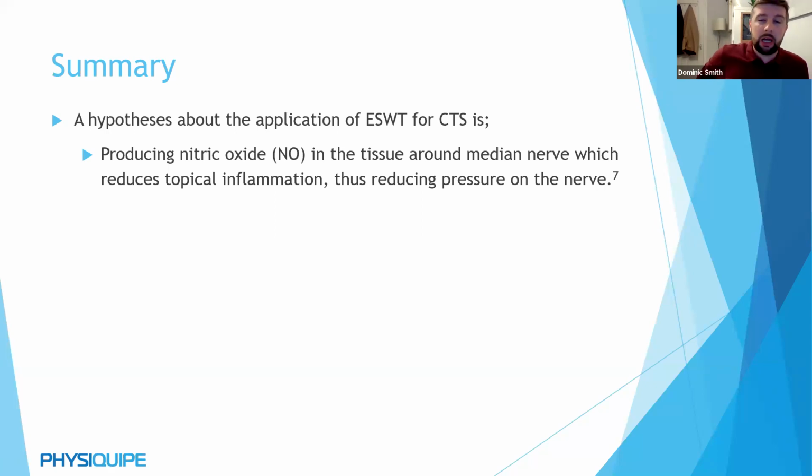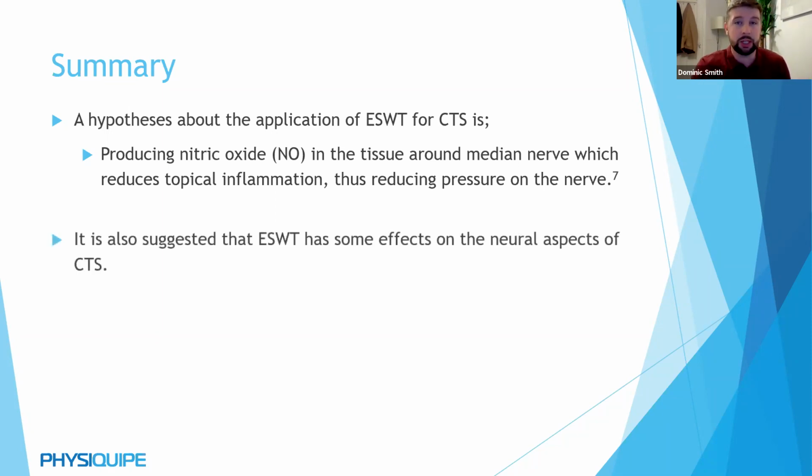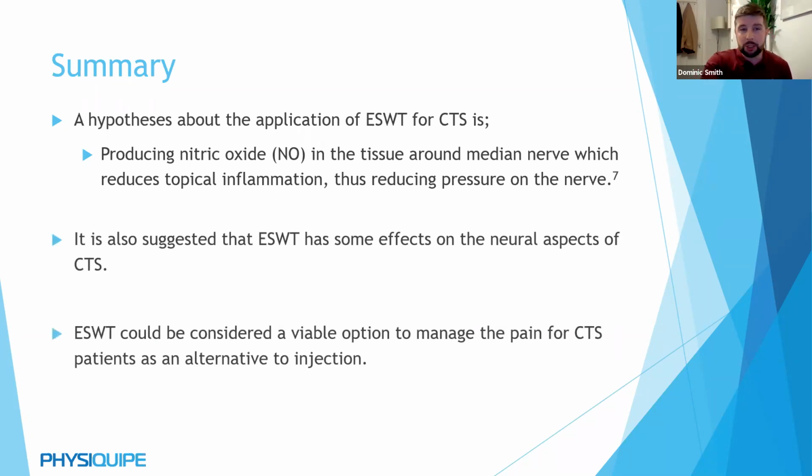And then again, in summary, if we look at the hypotheses that the researchers have been pulling together for Shockwave for carpal tunnel syndrome, there is evidence that it's producing nitric oxide in the tissues around the median nerve, which reduces the topical inflammation, thus reducing the pressure on the nerve. And that is the idea of what Shockwave is doing. It's reducing the pressure on the nerve. It's also suggested that Shockwave does have effects on the neural aspects and could be considered as a viable option to manage carpal tunnel syndrome as an alternative to injection, or if an injection fails, maybe it could be an alternative.